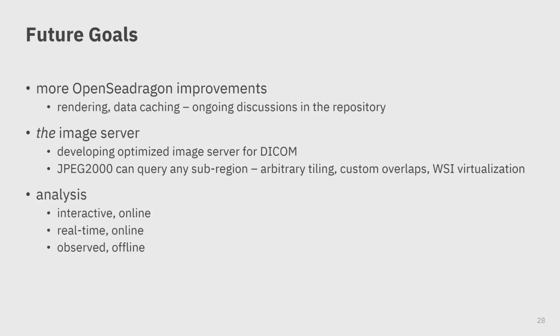As of now, the viewer works mainly with pre-generated pyramidal data. We would like to have a plugin that connects to our machine learning pipeline and allows for interactive analysis. Such analysis is already available in many viewers. Furthermore, we want to support real-time analysis, where prepared models are applied on the fly on tiles delivered to the client. To improve trust, we would like to have an ability to connect to an offline running analysis job. Such a connection would then prioritize the processing of regions present in the user viewport.